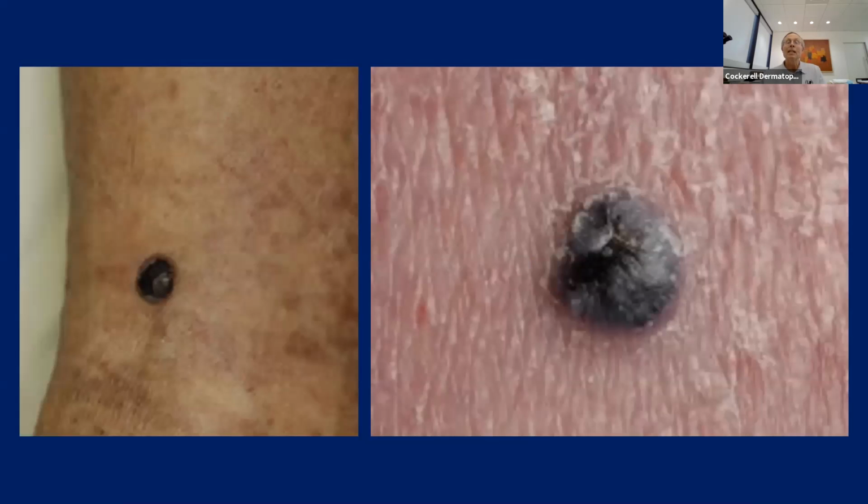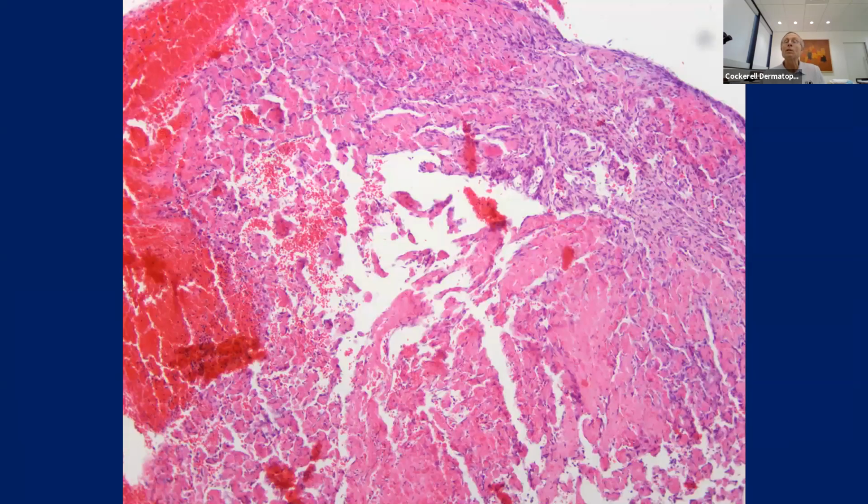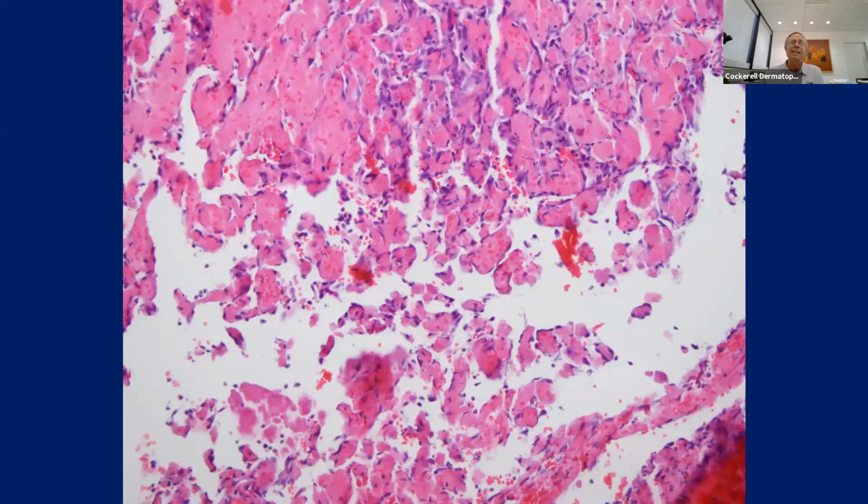Now, it kind of looks like this. And anybody know what causes this? What's the pathophysiology of this entity that's got this long name associated with it? Not so much ischemia from a clot, but yeah, this person Drew wrote down correctly. It's basically a blood vessel or even a hemangioma that gets traumatized, has thrombosis, and then it undergoes organization. So that's the key to the diagnosis. And the most important thing here is to remember that this is not an angiosarcoma. It's basically just a normal reactive vascular process.